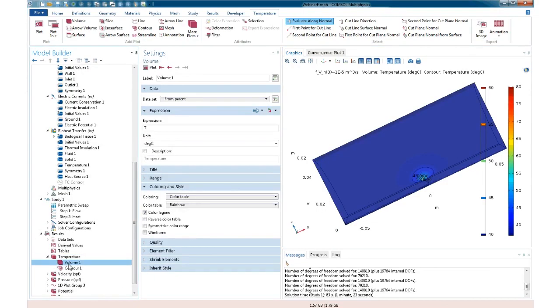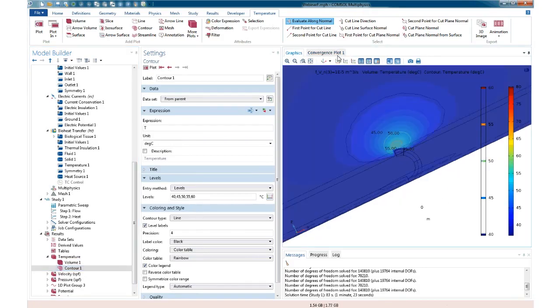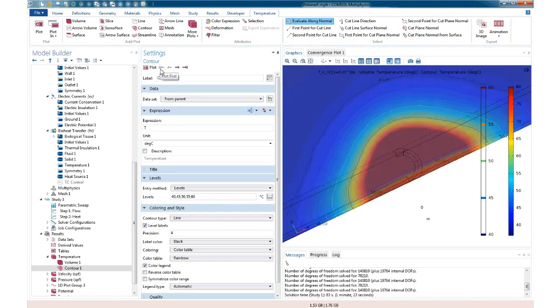And the action, all right. There we go. So this is the case where we have no blood flow at all. That's not a very interesting case biologically, but it allows us to take a look at the essential symmetry of the system. And as you can see, it's a little bit asymmetric because the electrode's a little asymmetric, but it's not a huge surprise. It's very hot in the center, and it cools down to our lethal temperature just about here. Now what happens when we turn blood flow on?